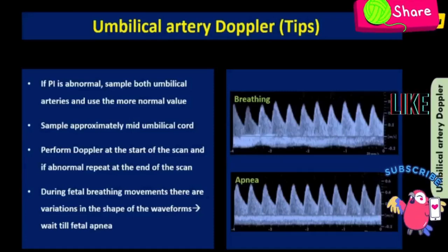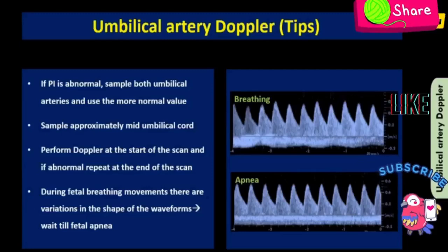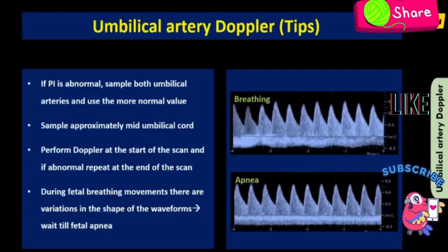During fetal breathing movements, there are variations in the shape of waveforms from fetal vessels. Therefore, Doppler examination should be conducted only during fetal apnea, and in the absence of fetal hiccup or excessive movement.